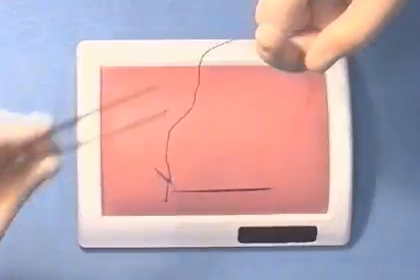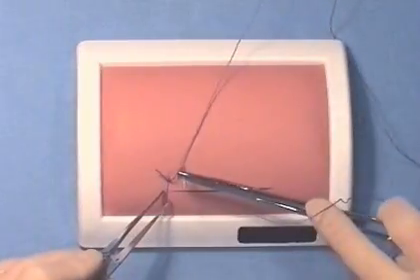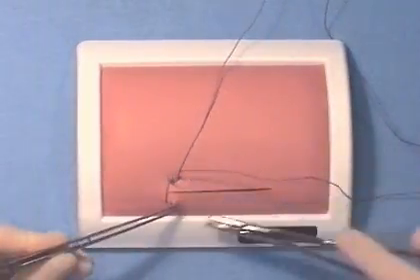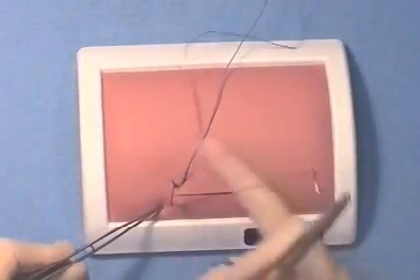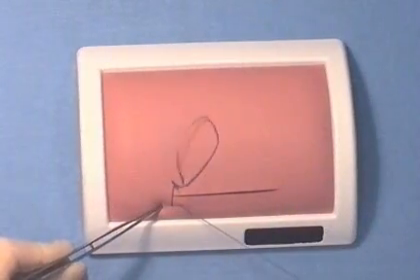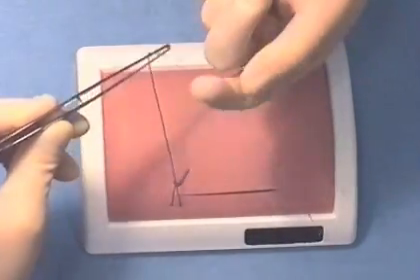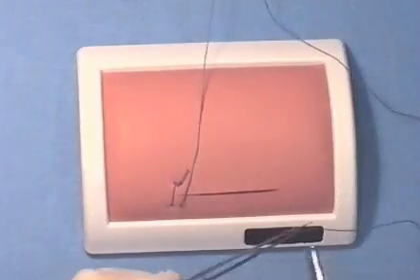The assistant should help by following. Following is a technique whereby the proximal end of the thread is held away from the wound, thus preventing it from getting caught in the wound edges at the subsequent throw or a knot inadvertently forming.